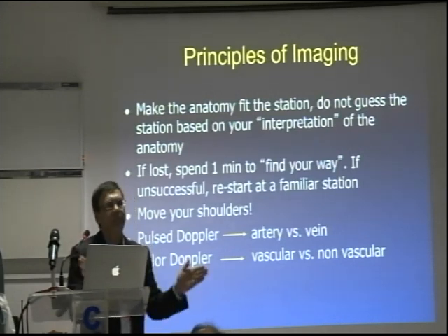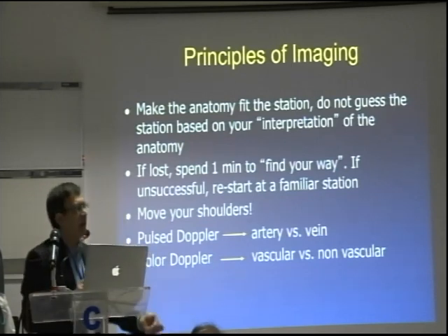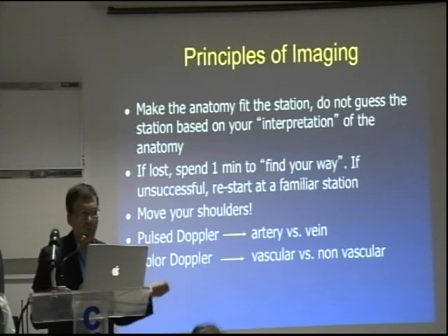But don't spend too much time. One minute, two minutes, you don't know what is happening. Always go back to the GE junction, or if you are in a duodenal bulb, go to the portal vein, or a familiar station, so where you can start over.